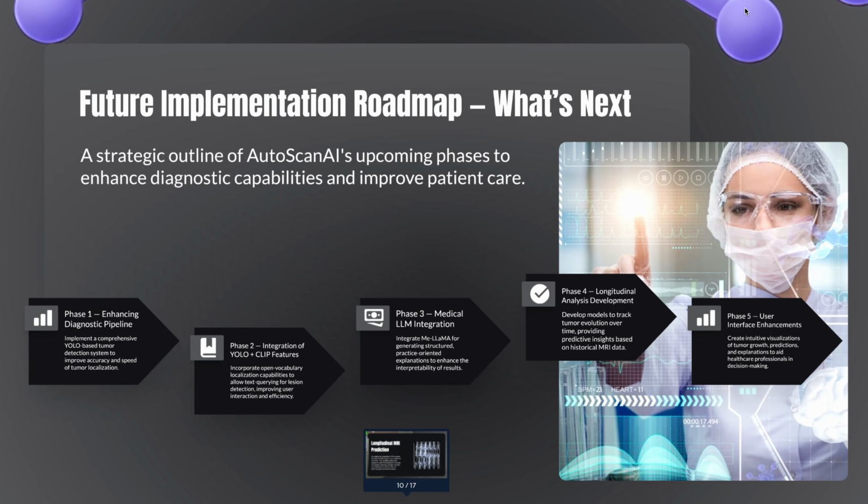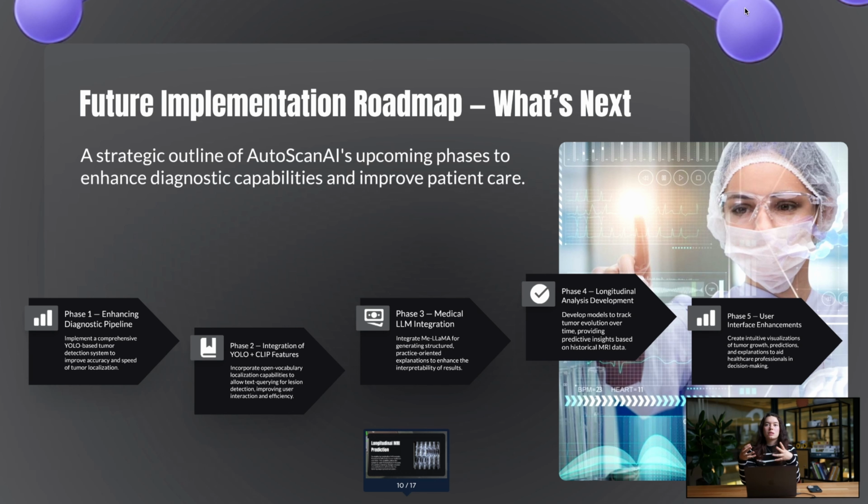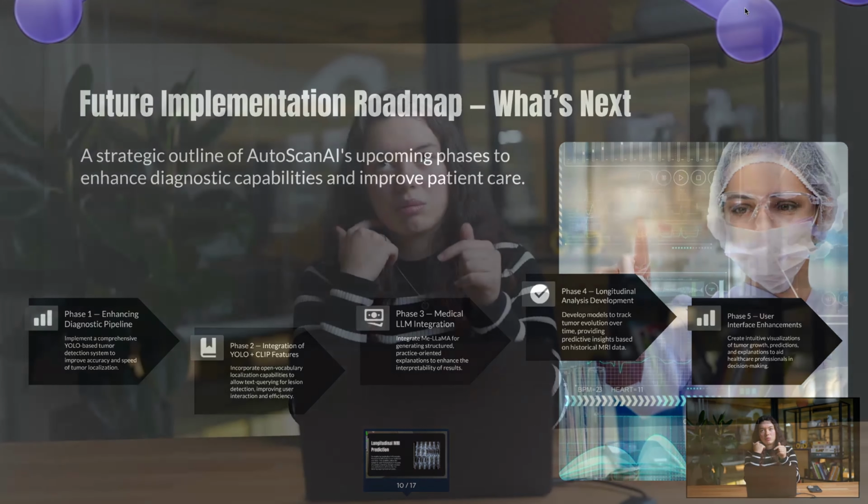So yeah, that's basically all I've been doing, and hopefully in a few weeks it will be implemented with everything: the explanation and hopefully the progression style, because I feel it's very important to have an MRI scan and that prediction, but it's more important to have it with a thorough explanation. Also maybe implementing a place where a doctor or a patient can ask questions, so it will be an AI that will respond to you, like any question, such as what do you suggest doing?